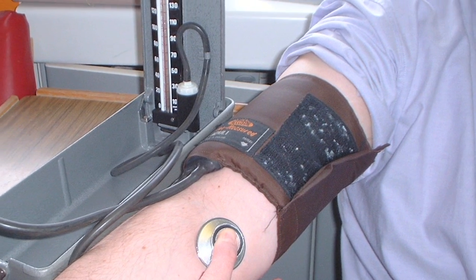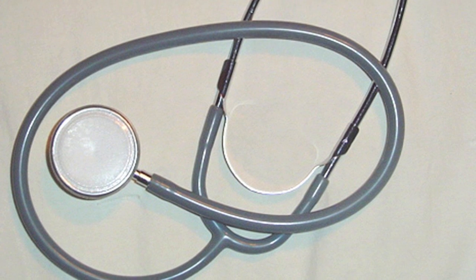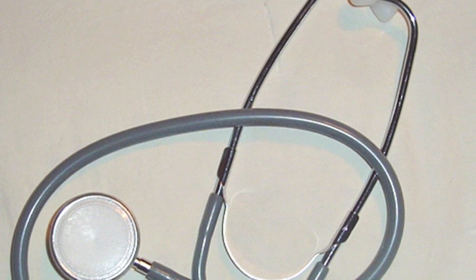The other way that we do it, which you'd consider the old-fashioned way, is a doctor, nurse, or other trained professional like an EMT uses a manual cuff with a little air bulb. It does the same thing — you pump air into the cuff around the arm — but instead of using a computer to hear the sound, you use a stethoscope. You're listening for the sound of blood flow returning to the artery in the arm that's been squeezed off by the air.